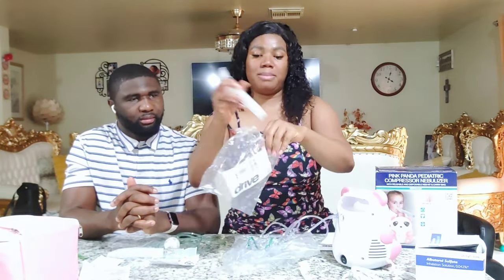You just take this off, like break it, peel it off, then just pour it around the cup. Pour it around the cup. You see what I'm doing? There you go. That's it. Okay, that's the medication in there. So that's the medication, and all you need to do is lock it up. Squeeze until it's done. Yeah, and that's it. So she breathes from it.